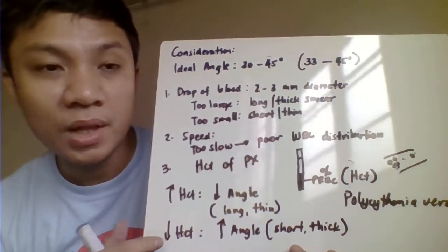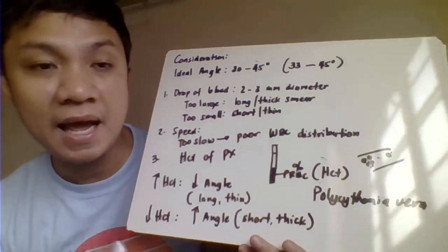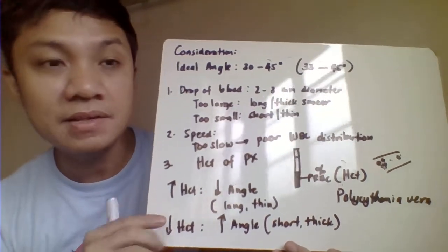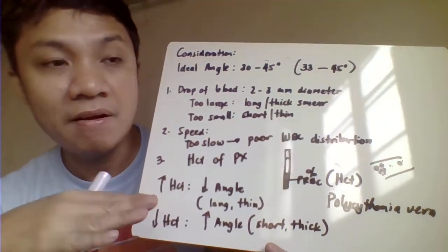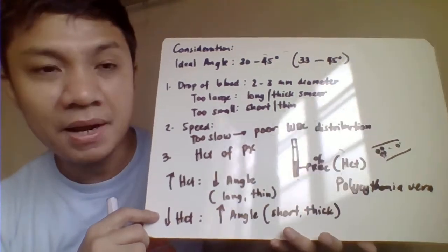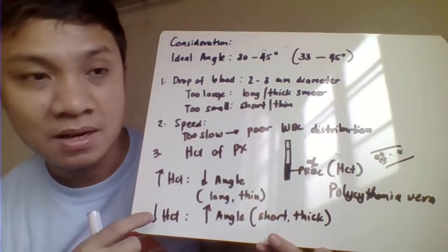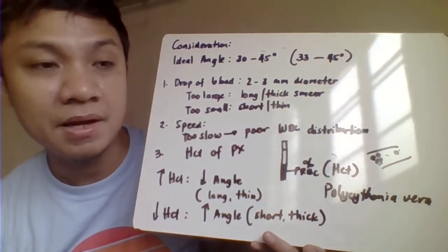Therefore, it will allow you to have a better morphology evaluation because the cells are not overlapping. And what you produce is not a thick film. So again, if you have increased hematocrit, lower the angle, and what you produce would be a thin film, but a much longer film. Because if you raise the angle further, it will become a thick and short film, and eventually the cells overlap.